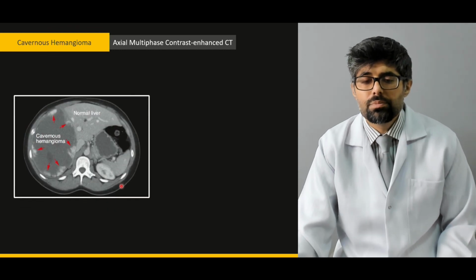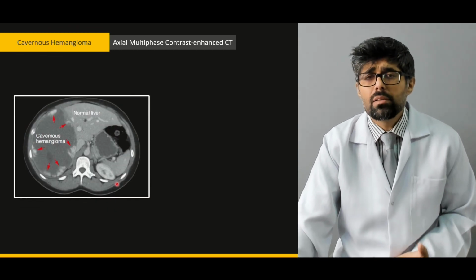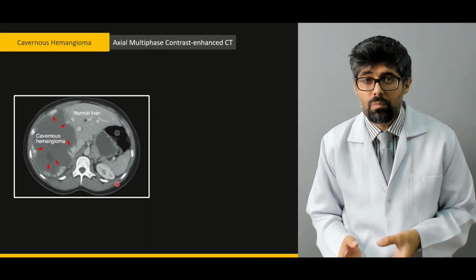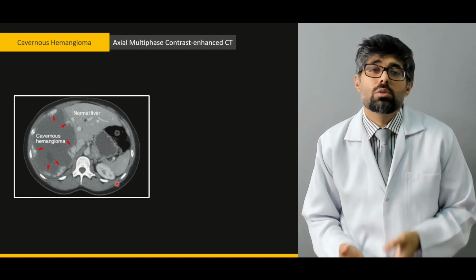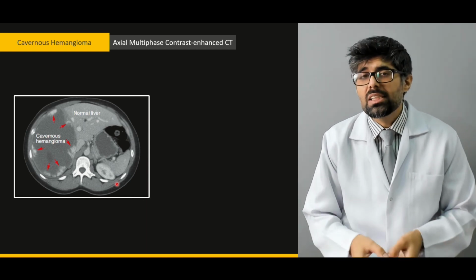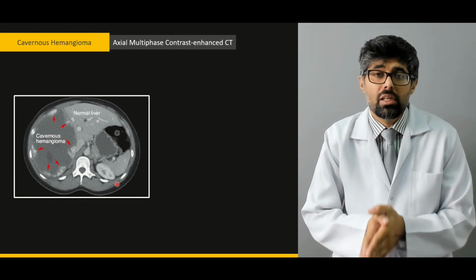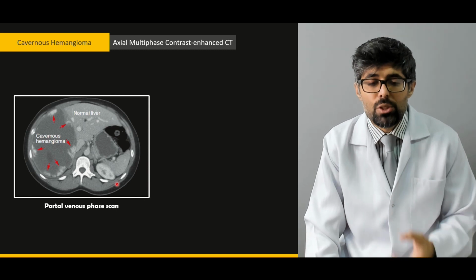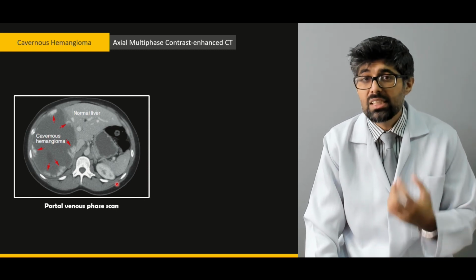Another cause of unexplained symptoms can be a cavernous hemangioma. Now, in order to diagnose a cavernous hemangioma, what we perform is called an axial multi-phase contrast enhanced CT scan. And for that CT scan, we use a portal phase scan.